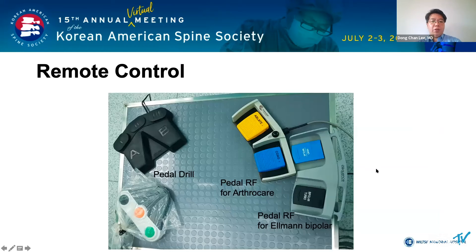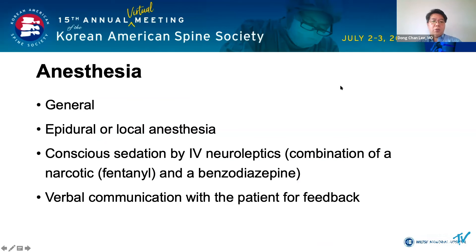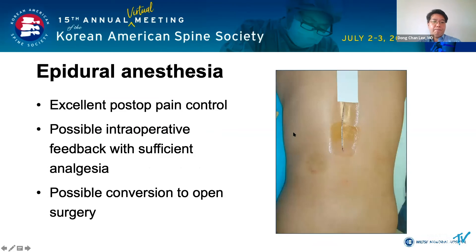This photo shows the setting of the remote control. The operation table is radiolucent and eccentric. Position the patient so that intra-abdominal pressure is not high. Endoscopic surgery is possible under general anesthesia, epidural anesthesia, or local anesthesia. I usually operate under epidural anesthesia, which provides excellent postoperative pain control and intraoperative feedback. You can also switch to open surgery if needed.